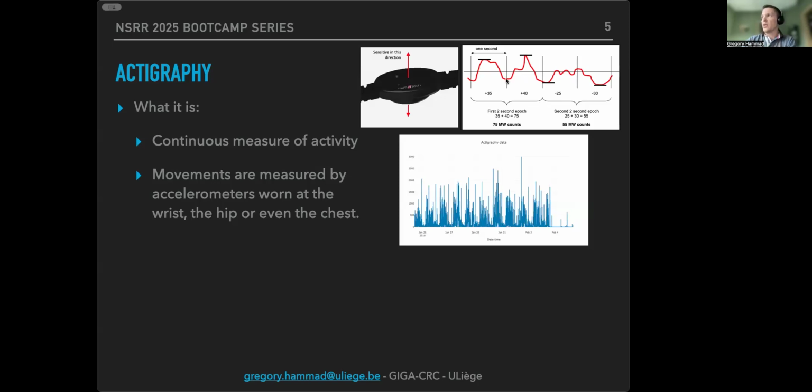But this processing is specific to the device. So if you are running two different brands or device types, it's hard to compare. The comparability across different devices and brands made it a hard time for us to pull data together. Nowadays, there are more and more devices that let you access the raw data, the raw acceleration. But then it's up to the user to post-process this acceleration.